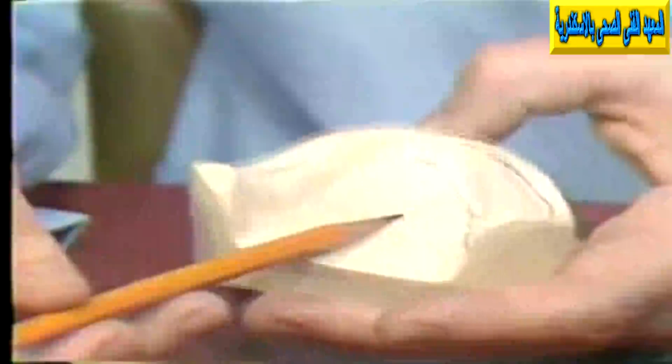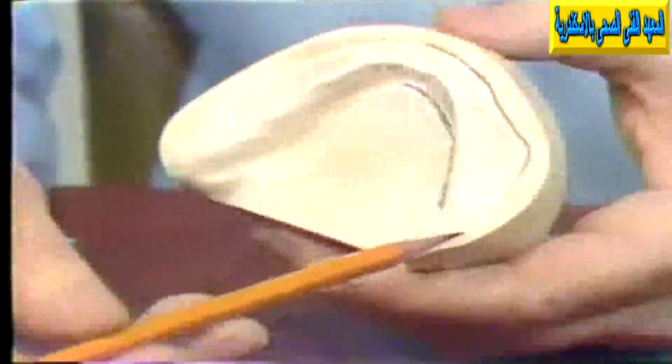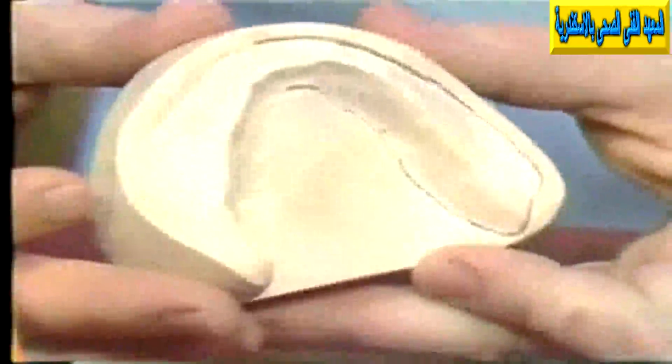Now, the lower master cast is basically the same. Regardless of which method you use to prepare the master cast, we want to end up with the same configuration. In the lower, the requirement is that the tongue space be flat. Also, we should have a landing or boxing edge, again, all the way around the master cast, of even width, about 3 or 4 millimeters, as we said before. And all of the tissue surfaces must be preserved.